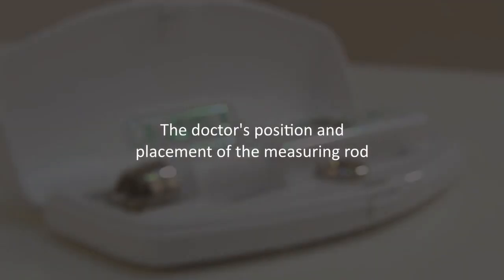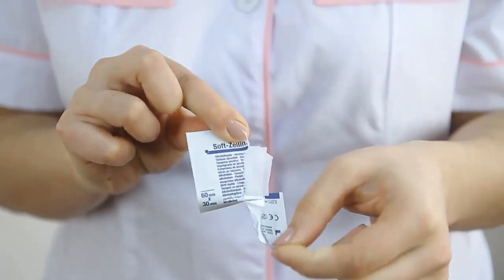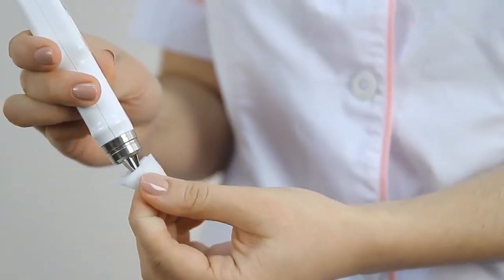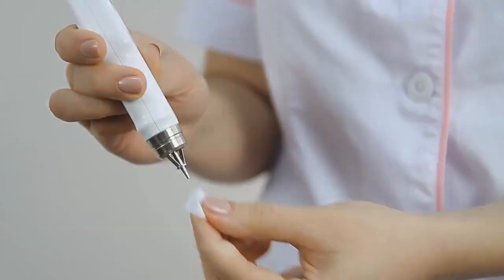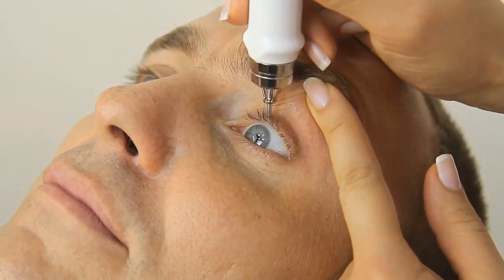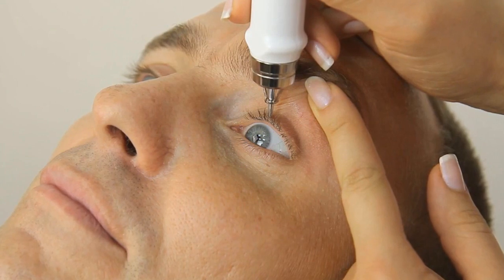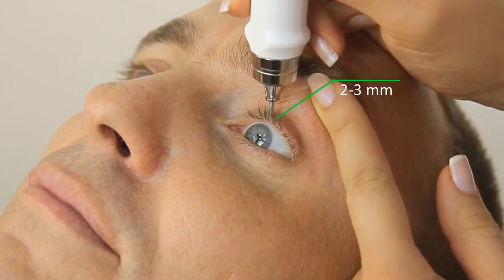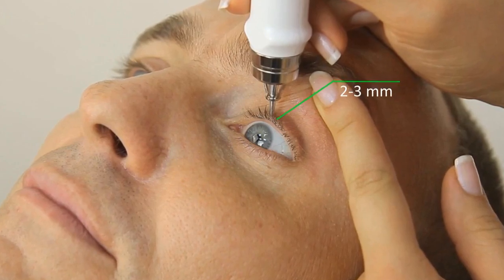The doctor's position and placement of the measuring rod: please make sure to disinfect the protective ring and vibrator rod before each new patient during the measuring process. The hand holding the tonometer should rest against the patient's forehead. Place the tonometer rod 2 to 3 millimeters above the ciliary margin of the eyelid.